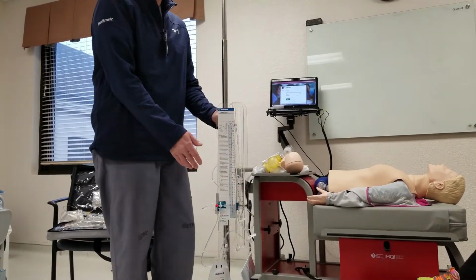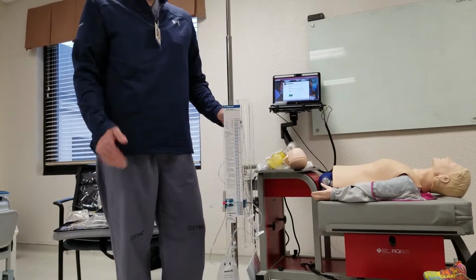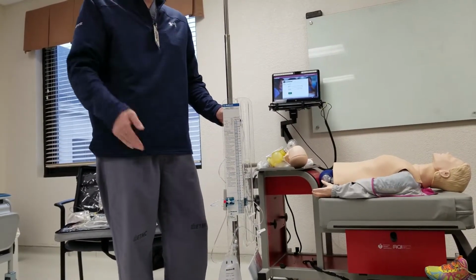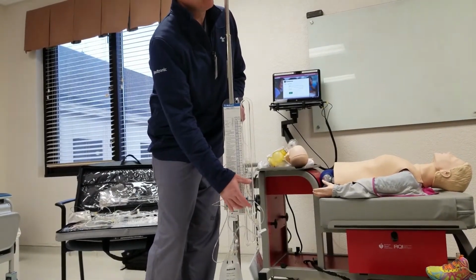And then you don't have to do, I mean, if you're managing them for 72 hours, that's a lot of math. Well, yesterday it was at 4:20, now it's at 5:30, and then today it's at 6:10. How much, in what timeline, whatever else. You're just using this graduated cylinder as your collection chamber.